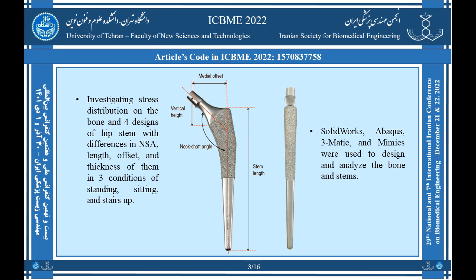Most studies have focused on detecting the mechanical behavior of the hip implant in the distribution of different forces, types of implant, mechanical design, or mechanical surface treatments during the manufacturing process. Obtaining the mechanical stress distribution patterns in hip replacement plays an important role in implant design and predicts potential problems such as implant loosening or the need for revision.